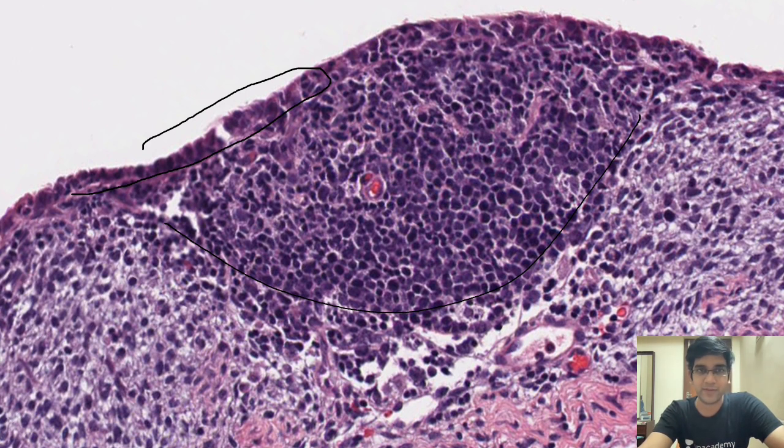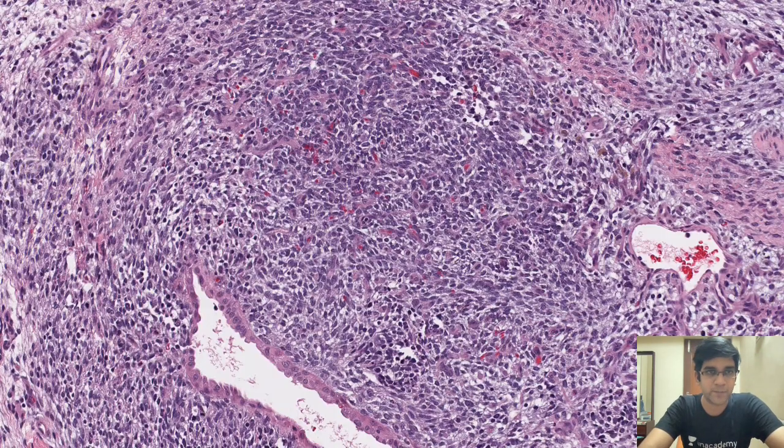The first thing for me, could it be a hematolymphoid lesion? Because ALL can happen, and ALL can go anywhere. It can also have a lung deposit. Who knows? It may have, right? So let's go ahead and see more things.